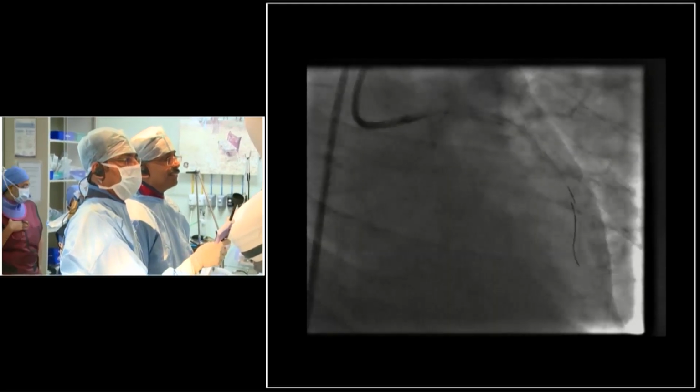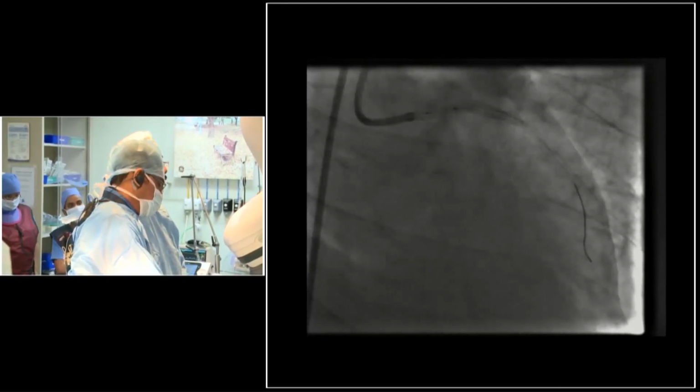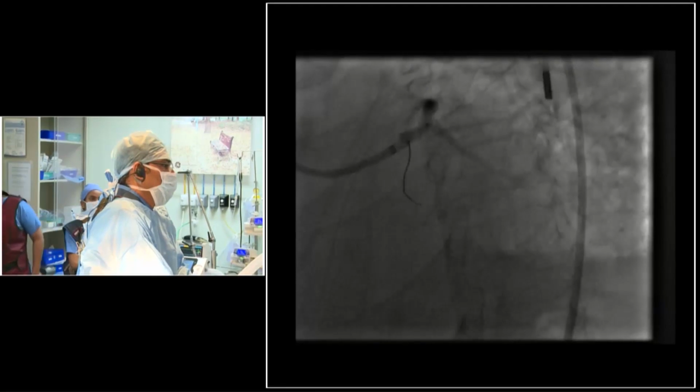So just now I checked. Okay. Go up. No, sir. We have to come back a little bit. Yeah. Leave a caudal, please. Quick. I think you can see both the branches are flowing. Hold it.